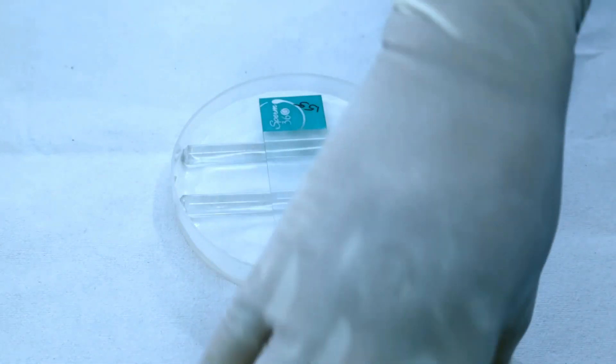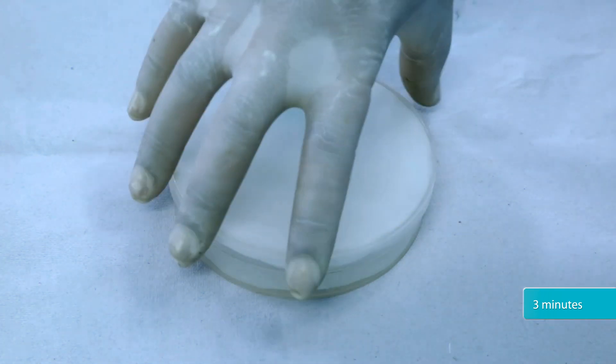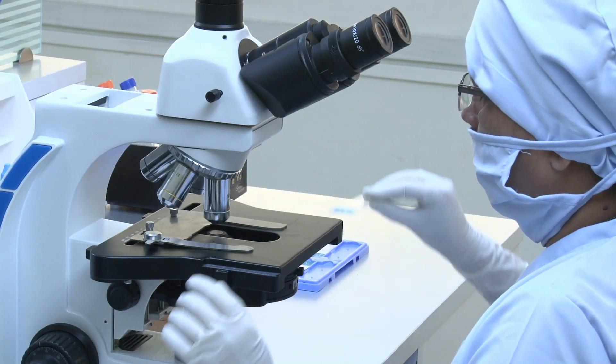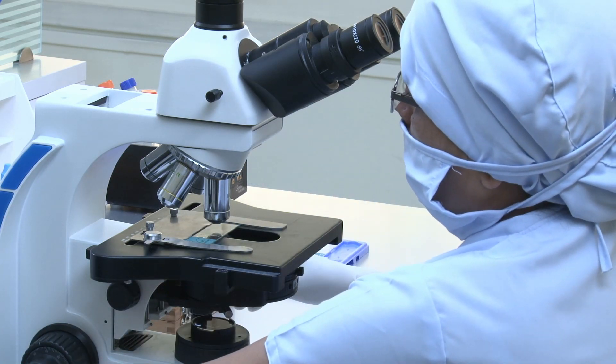Place the slide in the petri dish and incubate for 3 minutes. After 3 minutes, observe the smear under a phase contrast microscope using the 40x objective lens.